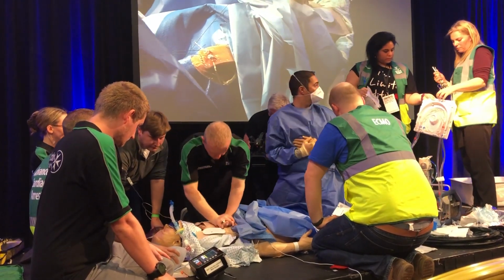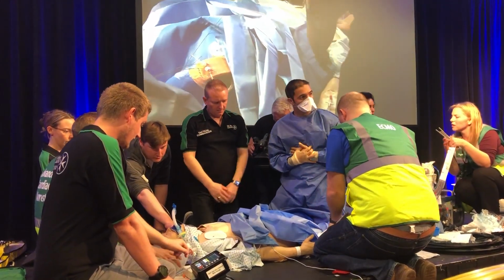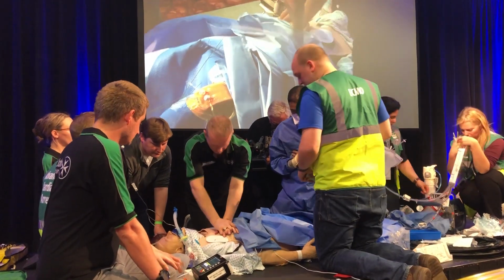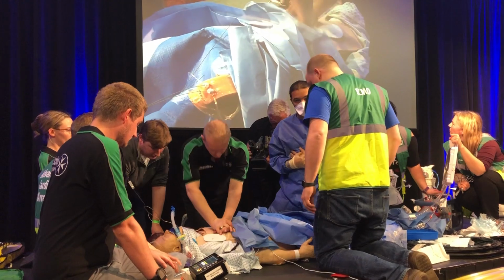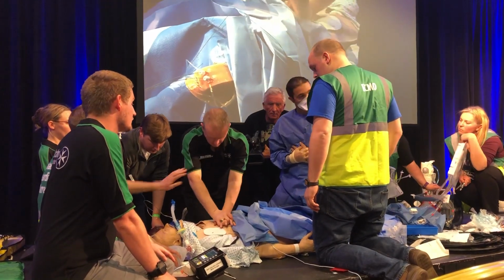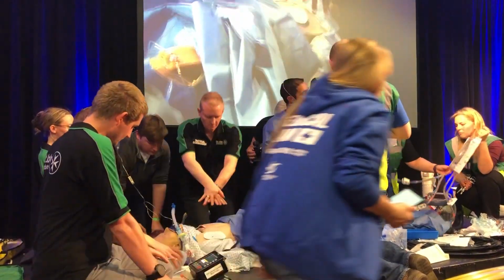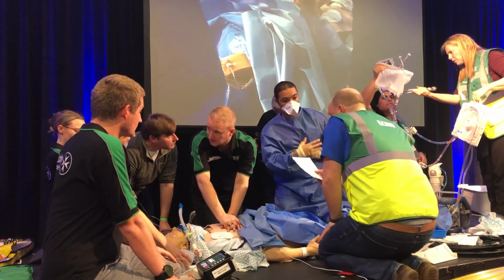It doesn't take us long to go on from this stage. And certainly for our sub-30 group that's got ethics approval, it's half the reason, that we were not taking away from what they would get if we weren't there. So 20 minutes, which conveniently is coming up right now, the team will go through a checklist. So you have 20 minutes, guys. Okay, Simon, could we do the checklist now? Sure. To you, Rob. Thank you.